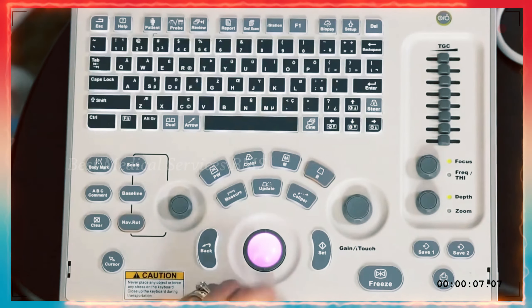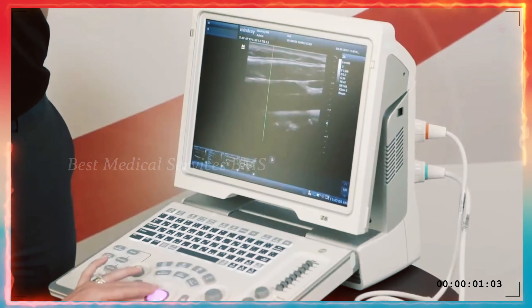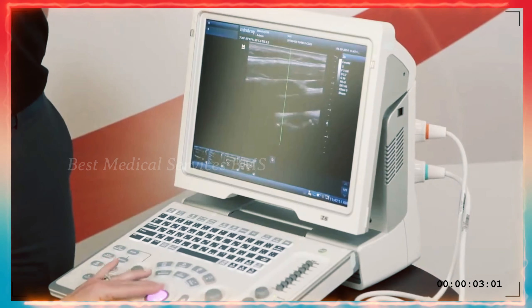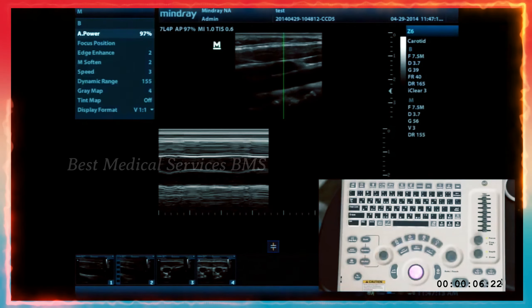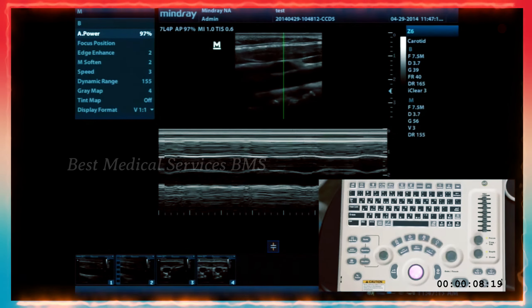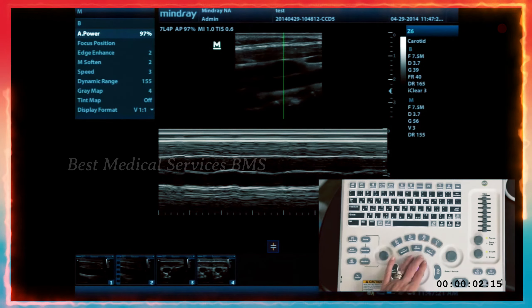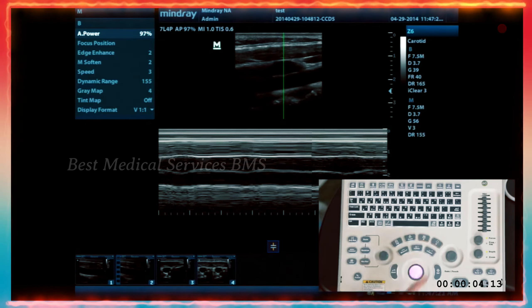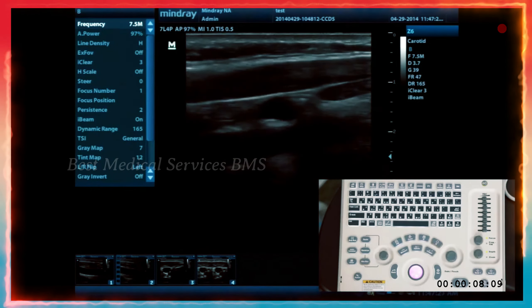When you press M mode, you get a green line that you can move back and forth with the trackball, and the update function allows you to start sampling. You're going to use that for fetal heart rates, pneumothorax, and emergency medicine. To turn M mode on and off, you can either hit M mode again or press the B mode button, which will always bring you back to basic 2D imaging.